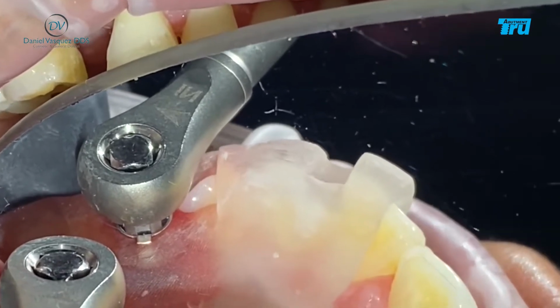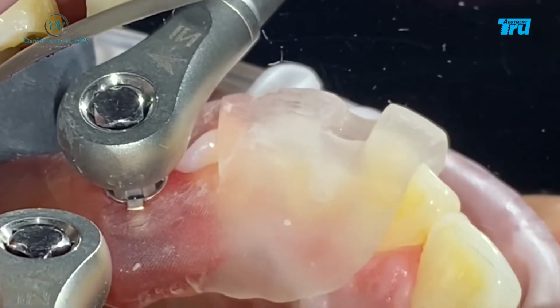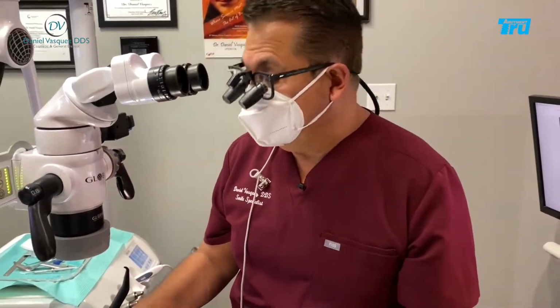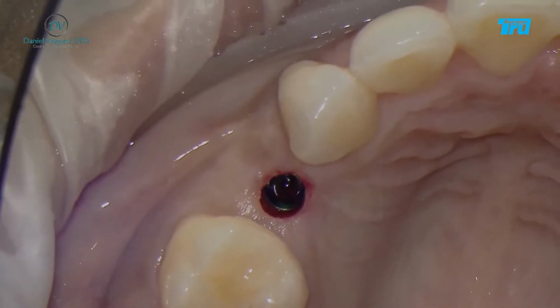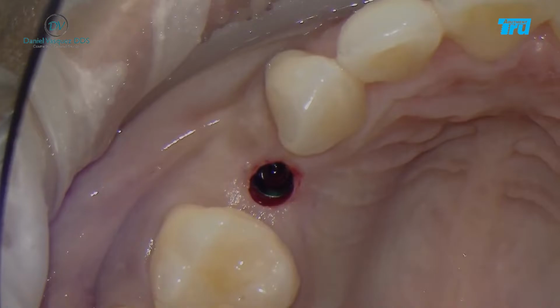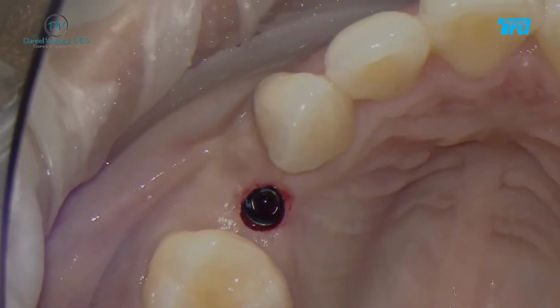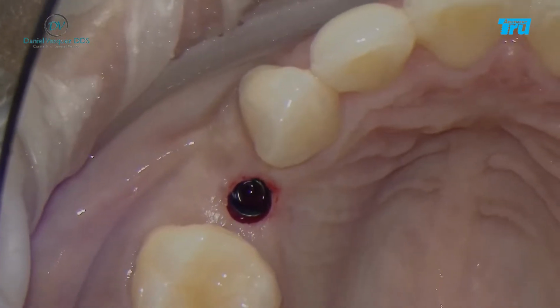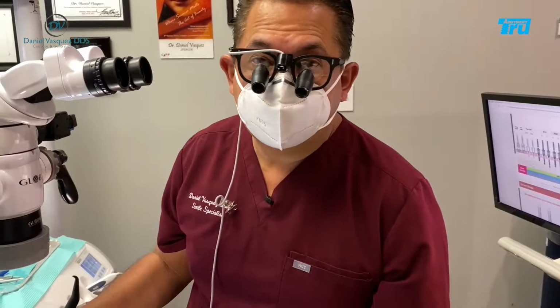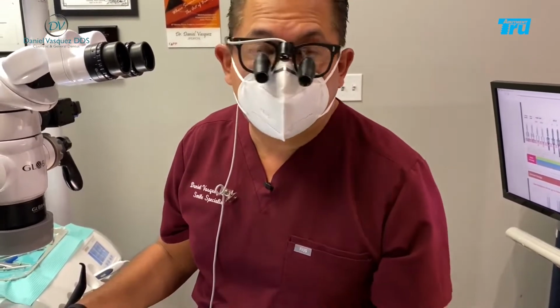So next thing, we're gonna remove the carrier, the surgical guide, and try our healing. The implant's been placed. It looks just beautiful. I have my microscope right now there, and as you can see in the screen up there, look how beautiful it looks. Now, next thing we're gonna do is try our abutment, make sure if it's perfect, and then just put the temporary crown, and we're done.